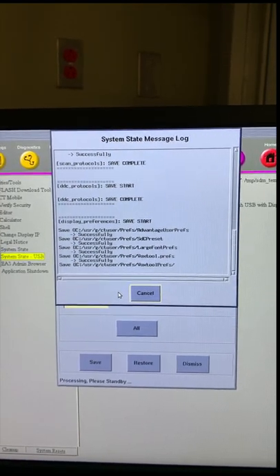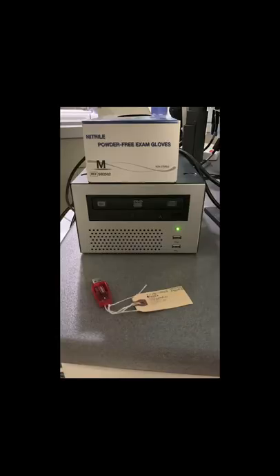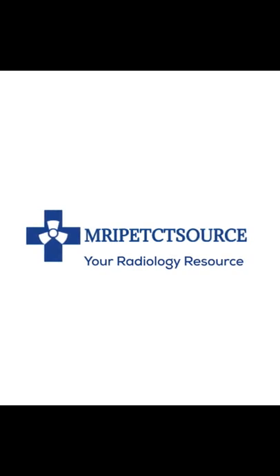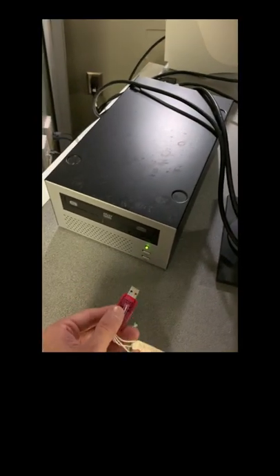Thank you for joining us. In this video we will be detailing how to save protocols and system state to a USB on your GE CT scanner.